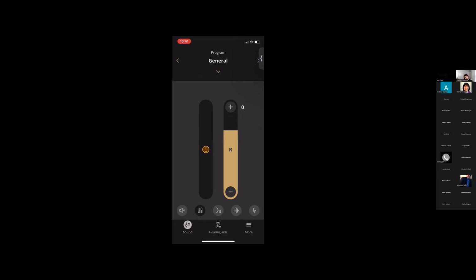Is that an impossible thing to try to fix? Is there a thing, say, for example, maybe not in Oticon, but in a music program, that can be adjusted so you can better understand what they're singing? I realize with an organ booming in the background, it doesn't always help. But is that an impossible thing to kind of fix?